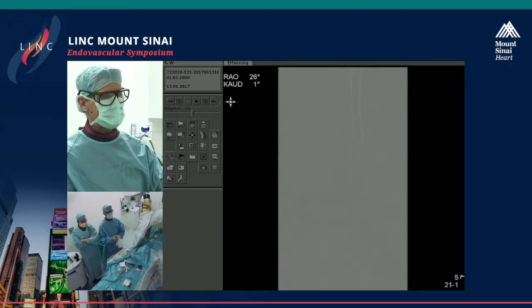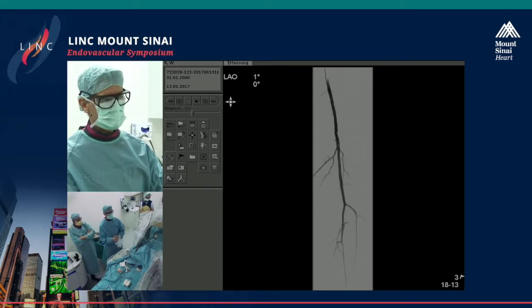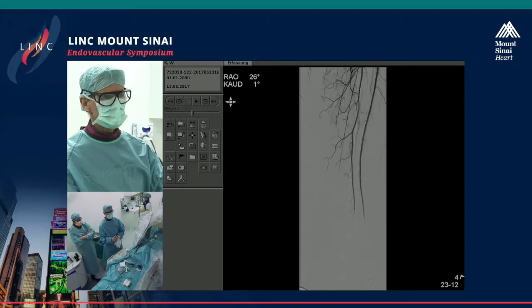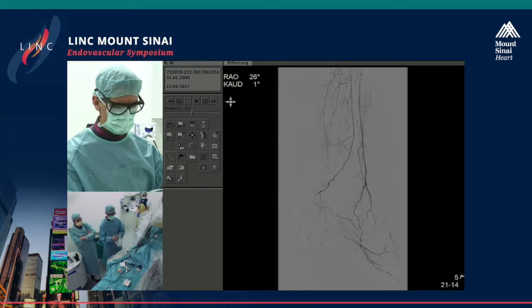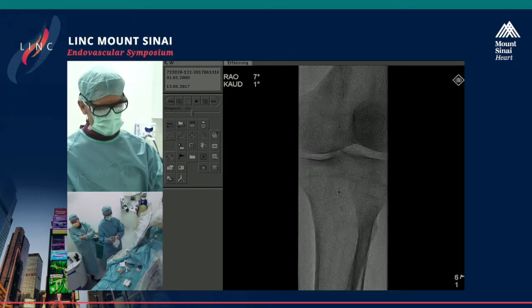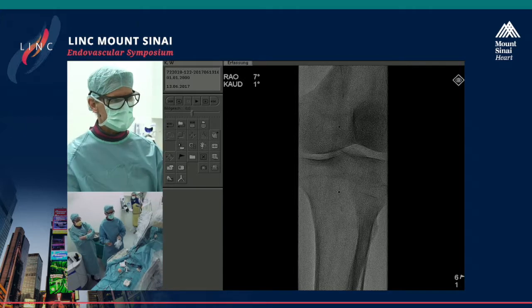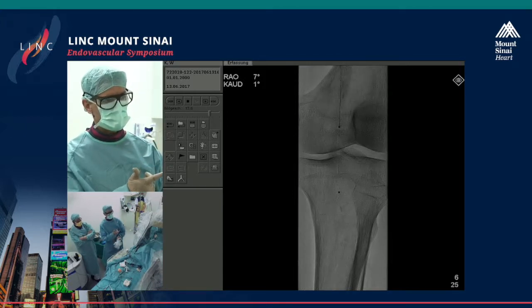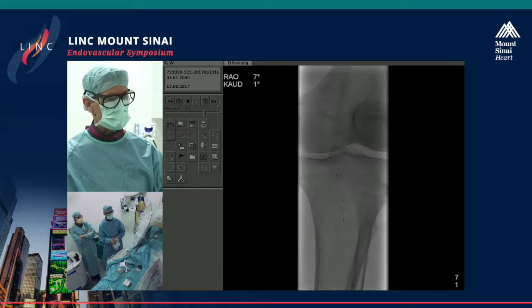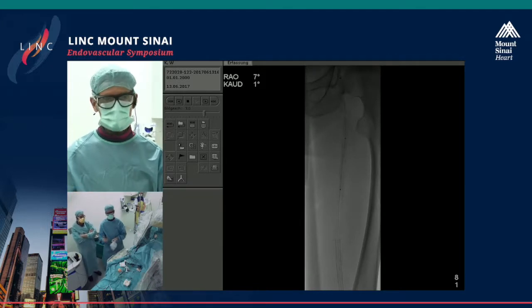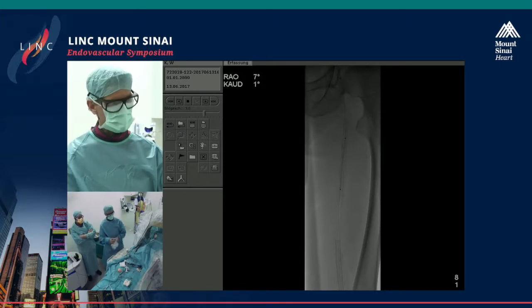Here is the poplitea, then open. We pushed down the quick cross catheter, and below the knee you can see the anterior tibial arteries — the strongest one filling the foot. We also have some disease. We wanted to do this with filter protection, so we took a filter down through the quick cross catheter and loaded the Spider filter directly through that catheter — 6mm. Then we delivered over a short thrombolysis side-hole catheter some thrombolysis: rtPA 8mg, and we waited 10 minutes.